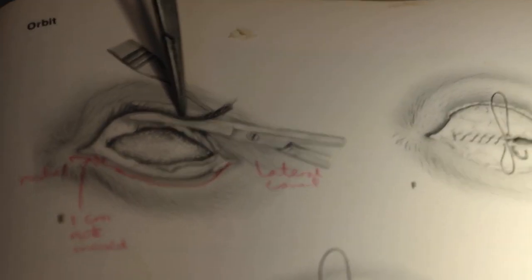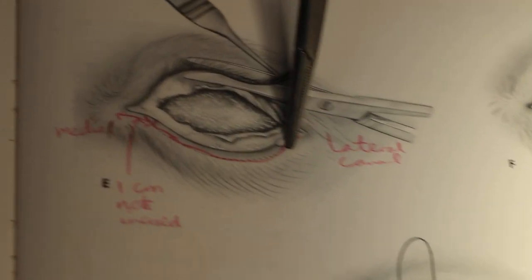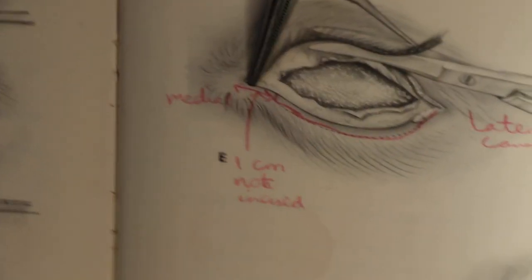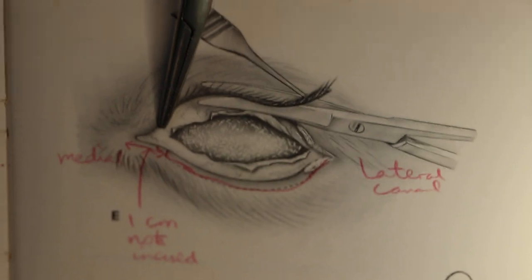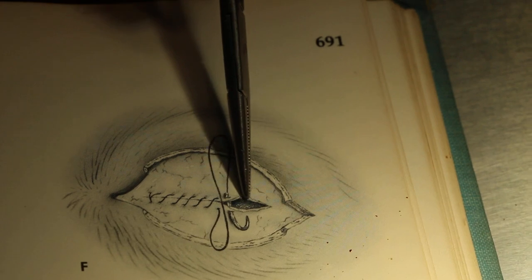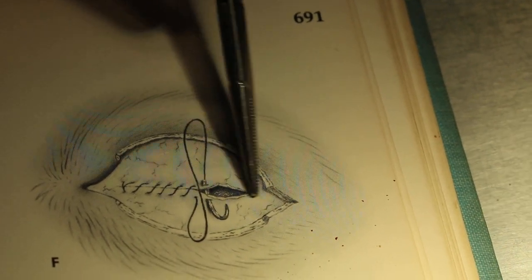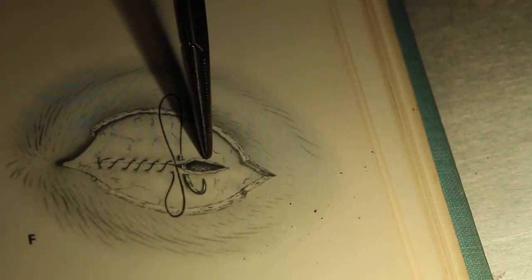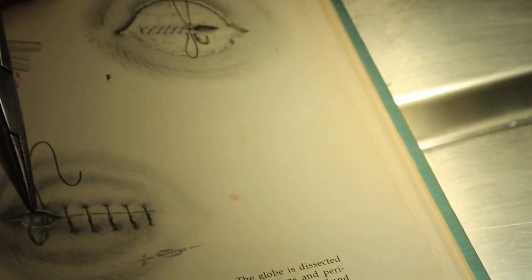From the lateral canthotomy side, I use scissors to cut the eyelid margins below the eyelashes — two strips — but stop about one centimeter from the medial canthus, meaning you don't cut all the way to the medial canthus. Then the next step is to suture the lid margins that have been removed. I suture the inside conjunctiva first, and then finally suture the eyelid margins.